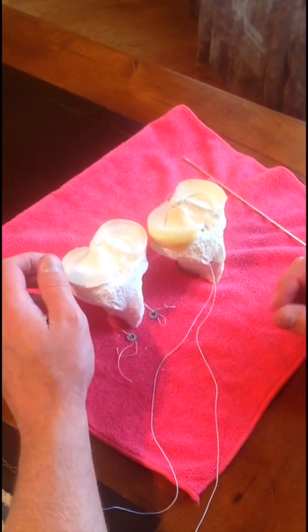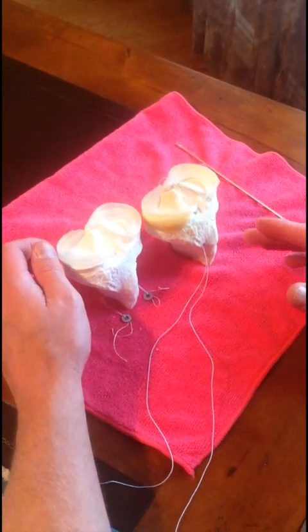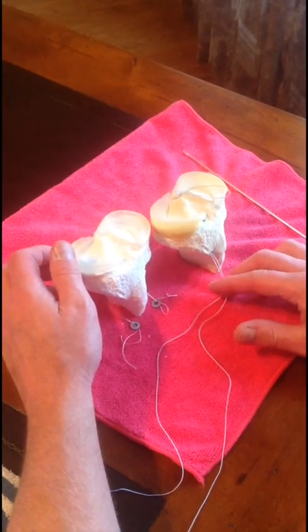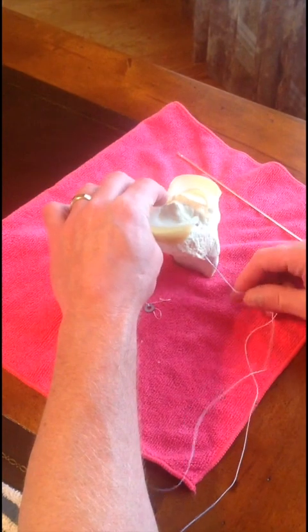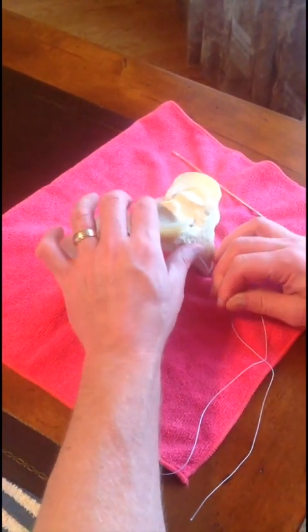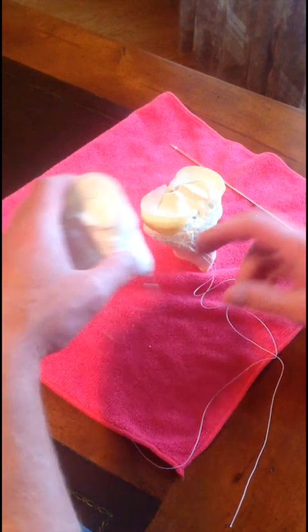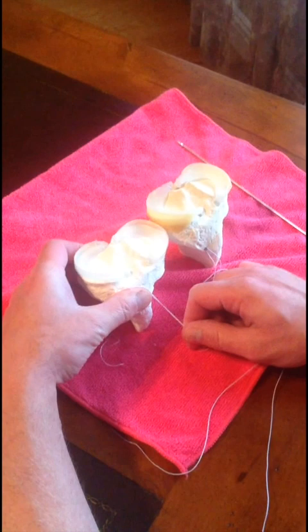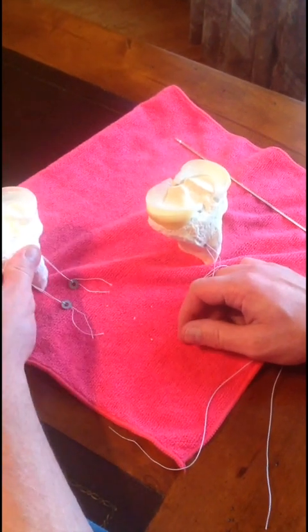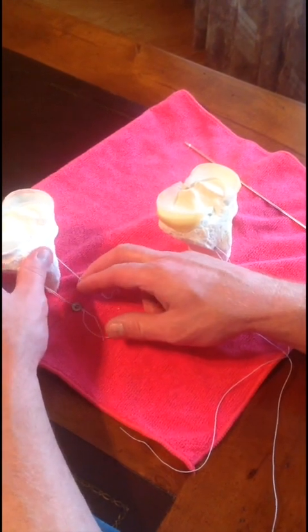People have also asked me about fixation on the tibia side. I actually prefer commercially available suture anchors that thread in. You can tie over buttons and it may be a little bit cheaper, but what I find is that actually broke the suture, so I had to go back and repass the suture limb, or conversely I can't achieve the exact tension that I want. If you're going to pass and tie over a button, then perhaps two sutures might be the way to go — you can tension with one then tie with the second one to maintain the tension on the repair site before tying down the tensioning suture.